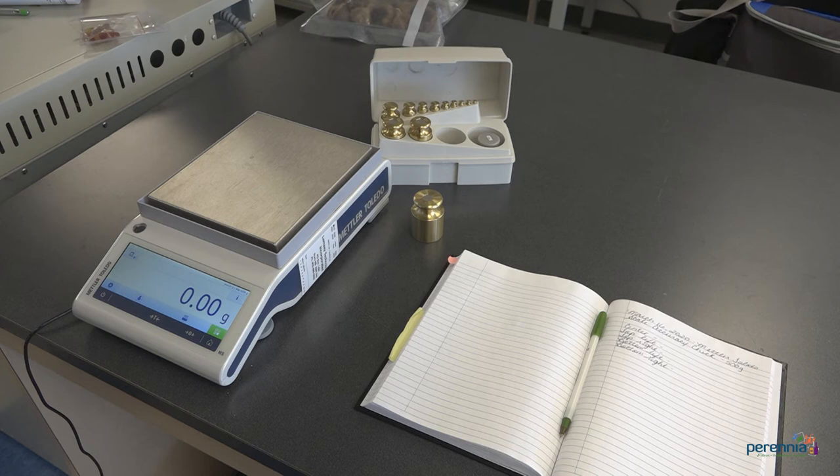It is important to understand the difference between a scale calibration and an accuracy check. Certified scales for trade can only be calibrated by a certified weights and measures technician, whereas scale accuracy checks can be performed by trained in-house personnel.